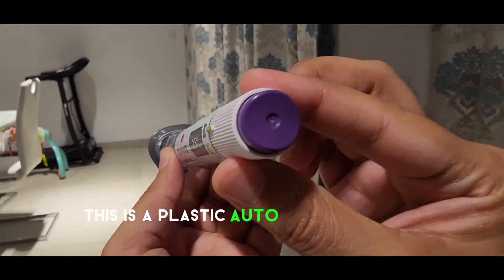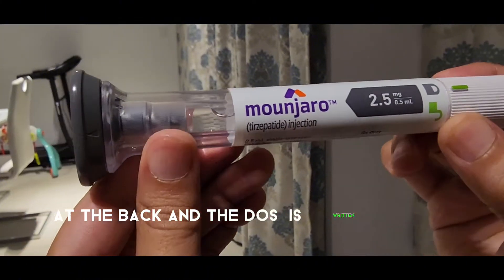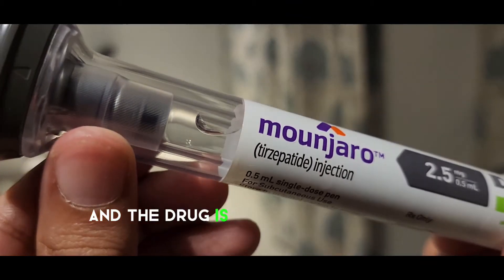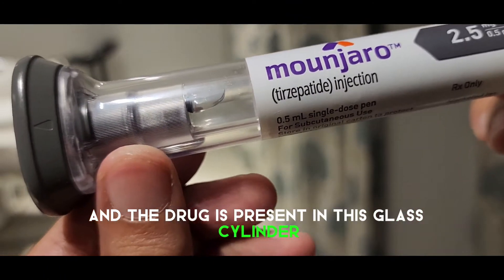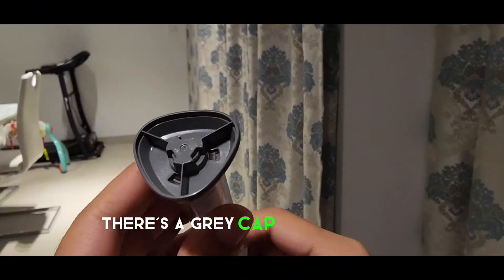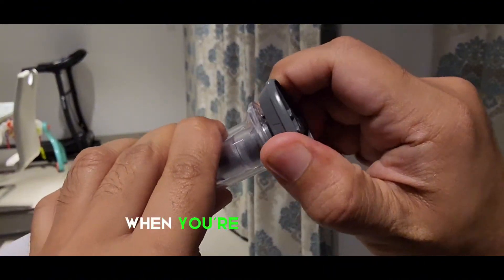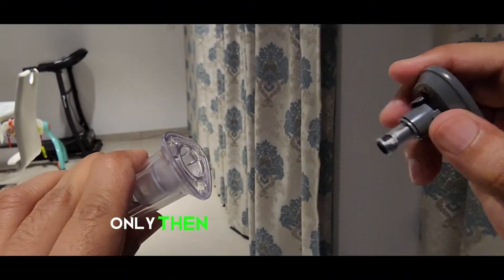As you can see, this is a plastic auto-injector with a purple button at the back. The dose is written with the name, and the drug is present in this glass cylinder with a bubble on the top. There is a gray cap at the bottom which conceals the needle. When you're ready to inject, only then remove this gray cap.